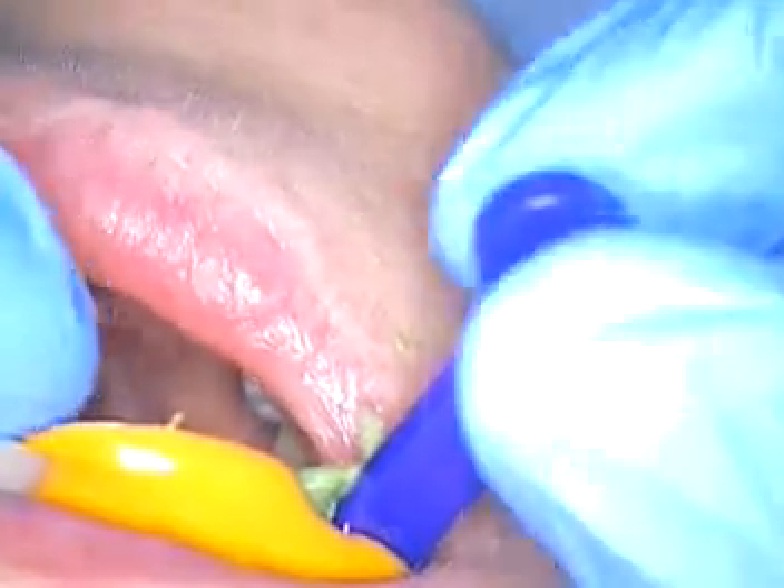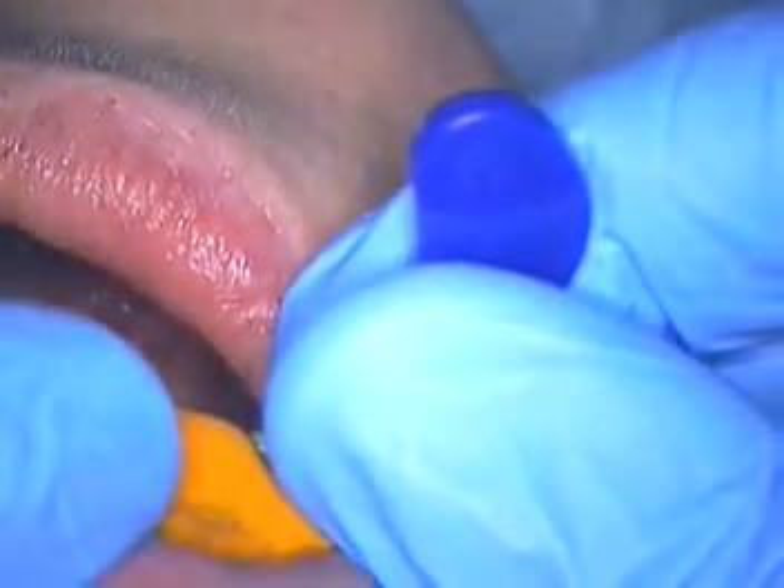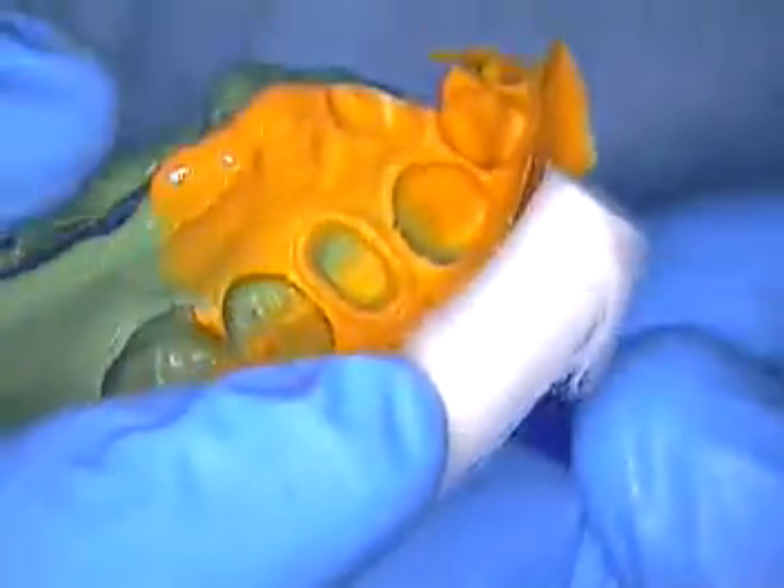Okay, so we're just coming in here. I'm just going to tease your impression out now, just gently. Alright, looks like you bit down perfectly, Victoria. Very nice job. And we're going to just visually inspect our impression. We notice that we've got a nice margin all the way around, 360 degrees.